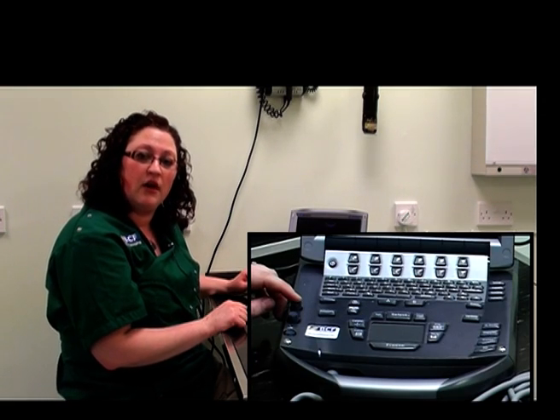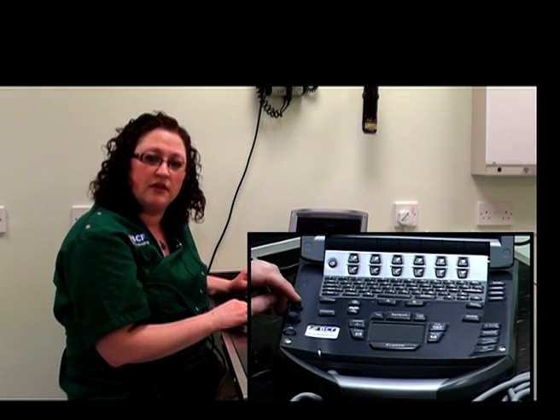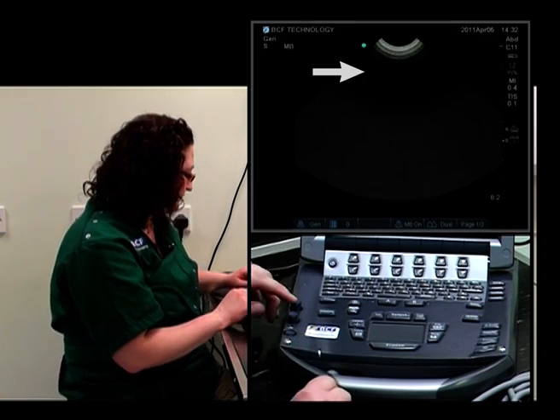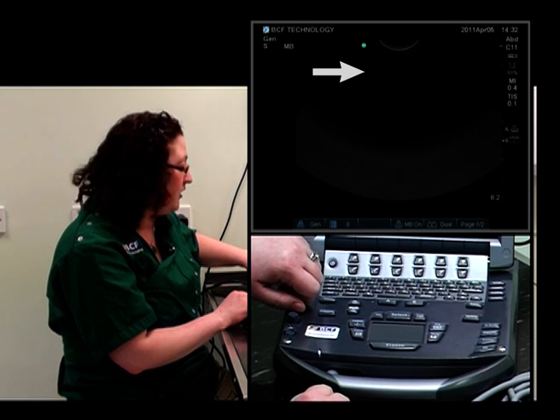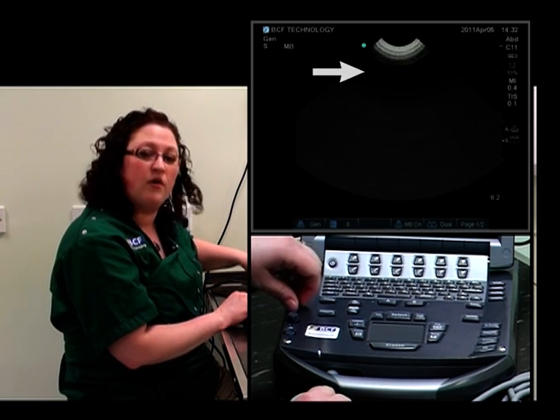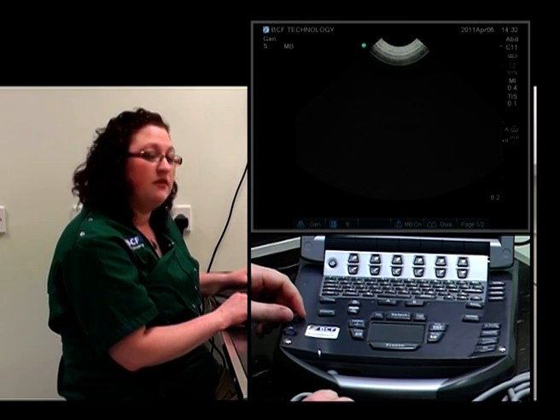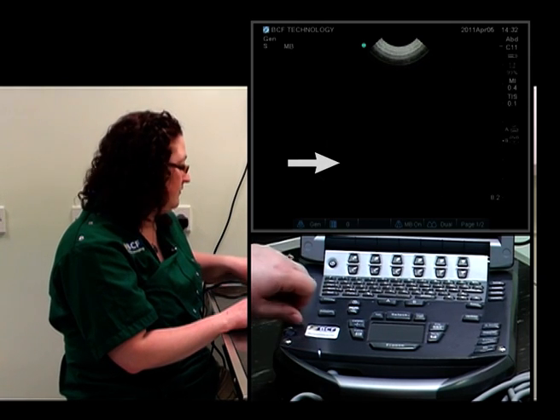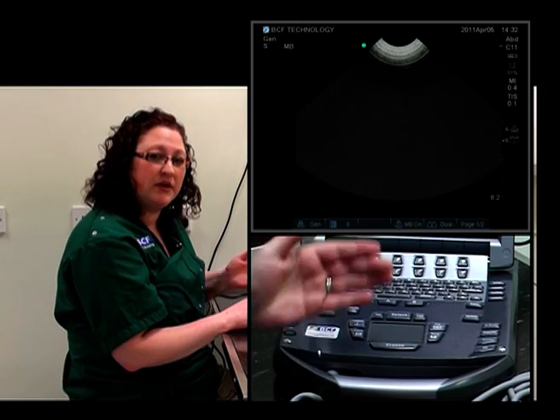On this machine, the time gain compensation controls are two pop-up buttons. The first one adjusts the near field, which is the area of the image closest to the probe itself — we can make the near field darker or brighter accordingly. The same goes for the far field. You want it to be nice and even all the way through. On some machines, these are a set of sliding buttons, but because this is quite a portable machine, they've made it as two buttons instead.